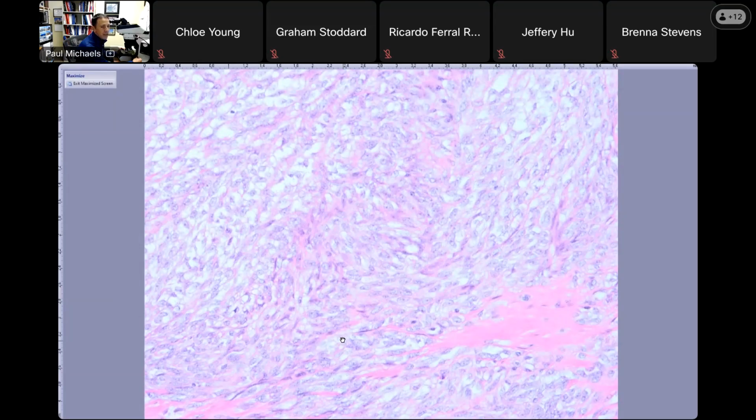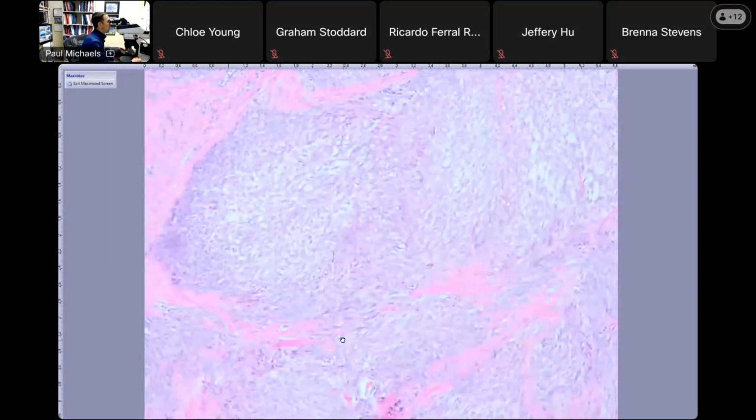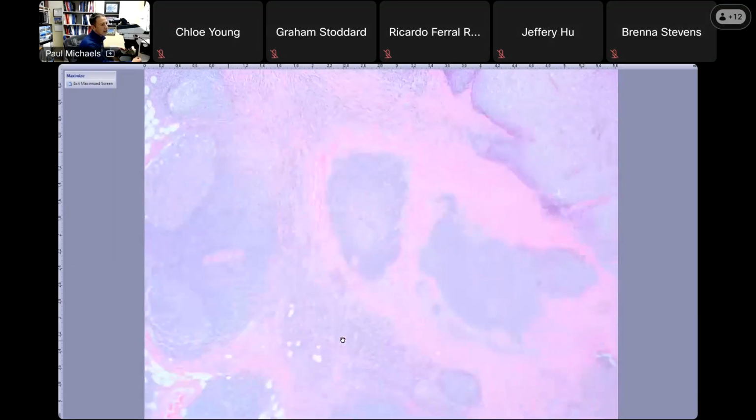They don't stain positively for MELAN-A a lot of times. So the clear cell sarcoma of the GI tract, some people will call it that if it stains for the melanocytic markers like MELAN-A, HMB45, etc. And if it doesn't, they'll call it a malignant gastrointestinal neuroectodermal tumor. They're probably a spectrum of the same lesion. They all have EWSR1 mutations, and that's how you really tell them from melanomas. You should probably do molecular testing in these.